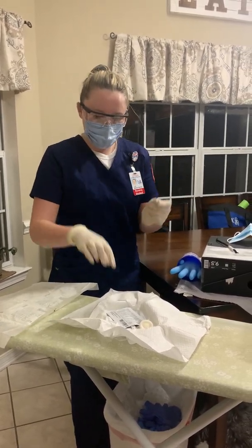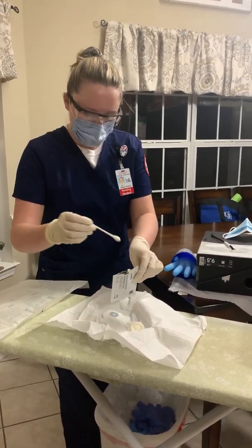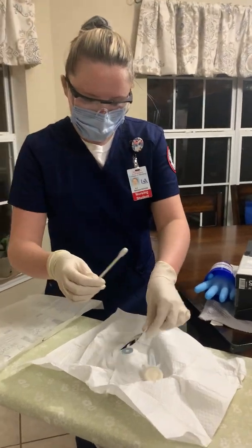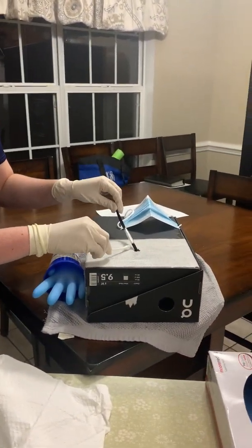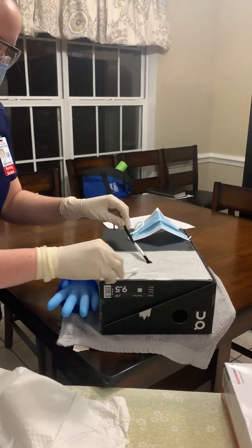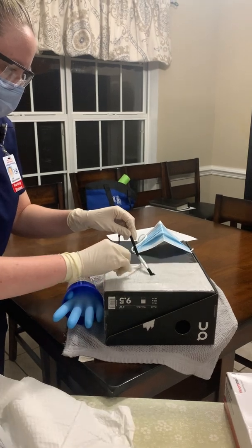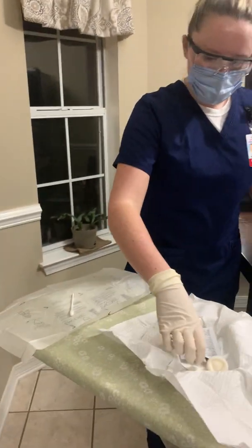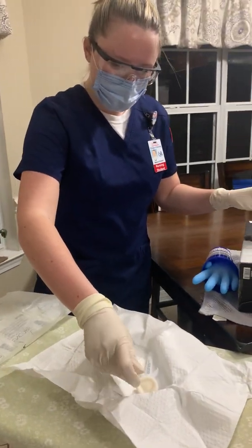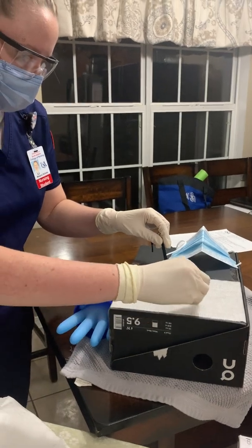They're both sterile right now, so I can reach into my package and grab my alcohol swab. I'm going to hold my central line. This hand is now unsterile. And I'm going to go in fanning motions, 2 to 4 inches around the dressing, careful not to go over where I just went. With the same alcohol swab, I'm going to grab another one and cleanse.